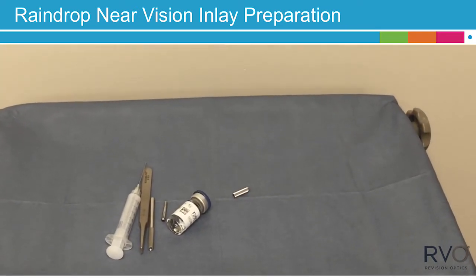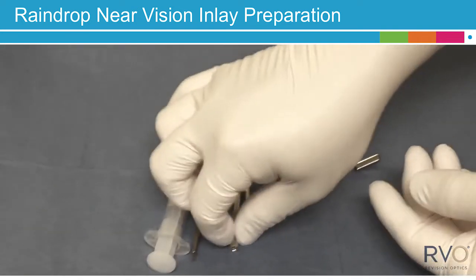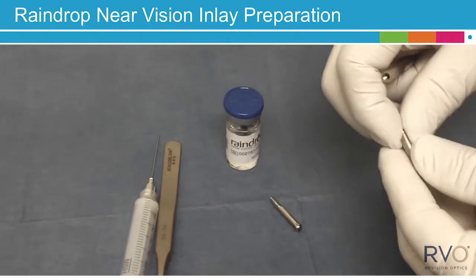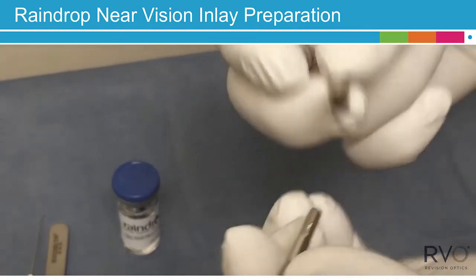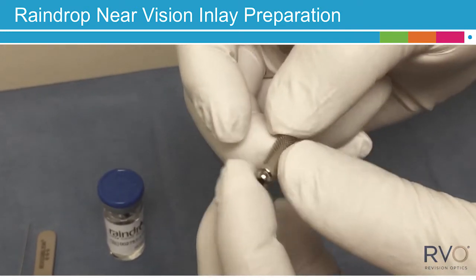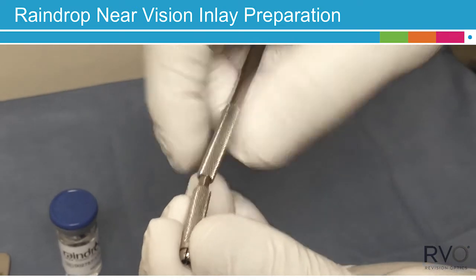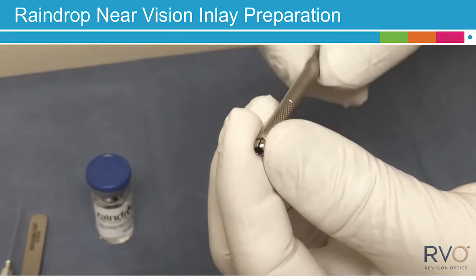Now you can begin the final surgical preparation for the Raindrop Near Vision Inlay. While wearing nitrile powder-free sterile gloves on both hands, assemble the inserter handle by first inserting the chuck's screw end through the sleeve via the ring end of the sleeve. Then screw the handle into the chuck sleeve assembly, holding the chuck's round open end and sleeve together.